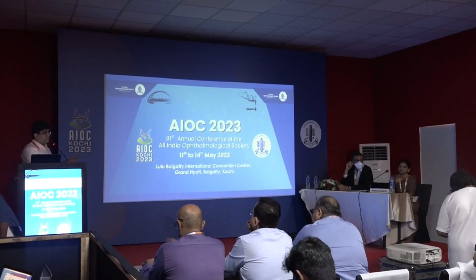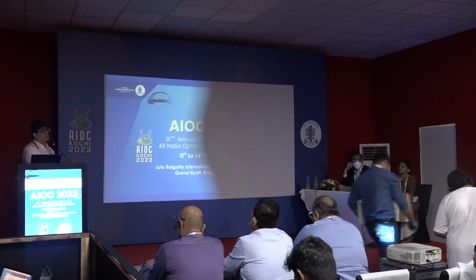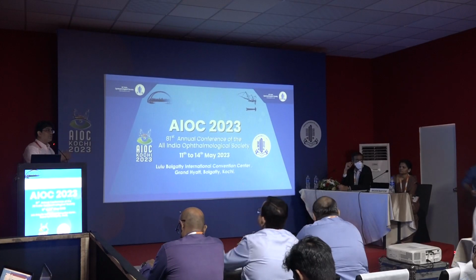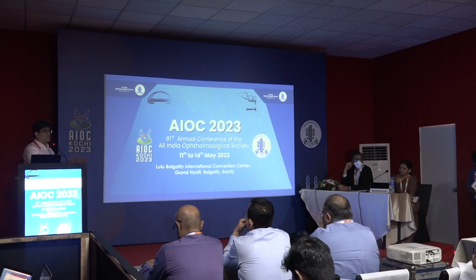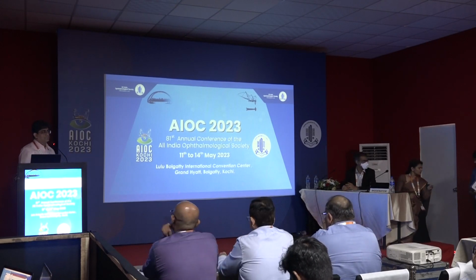This is not for commercialization. This answers a basic question. How do you know how much stereo acuity your chart is giving? No stereo chart tells you how much stereo acuity will be at a different distance. Basically, it is like this chart is there, you have to use it at 40 centimeters, and you will get this much stereo acuity. Yeah, that's what I'm saying.